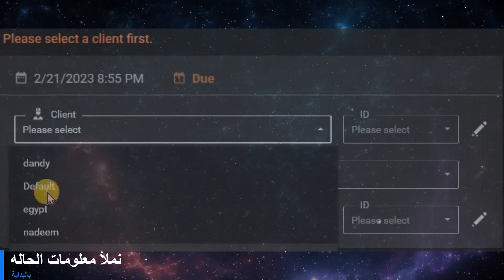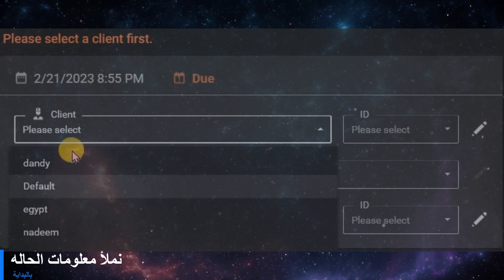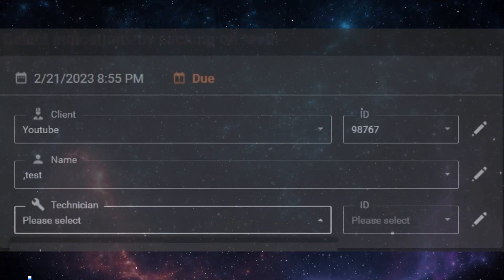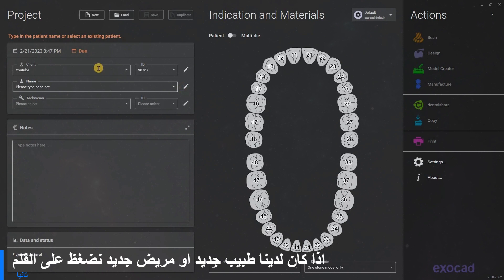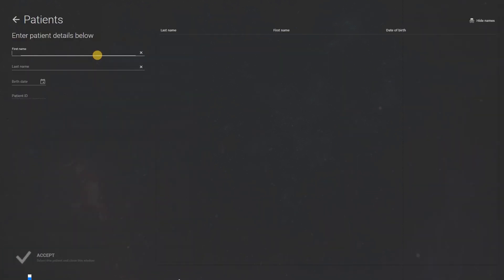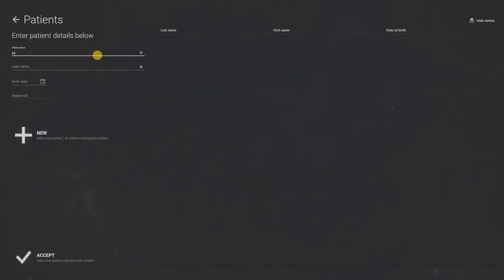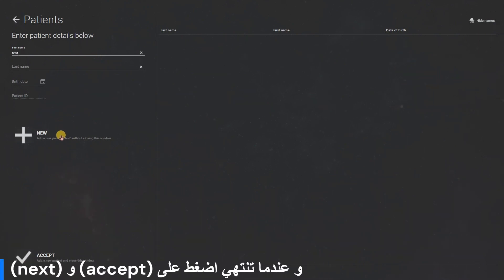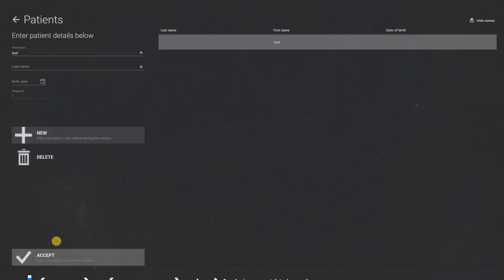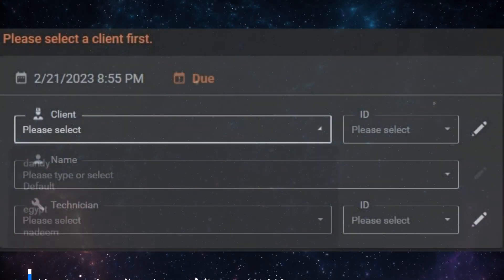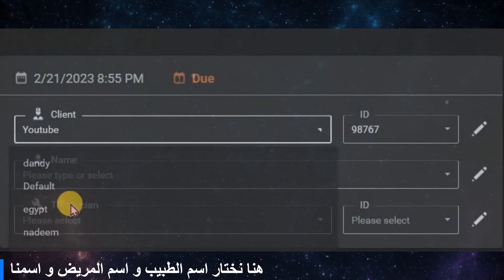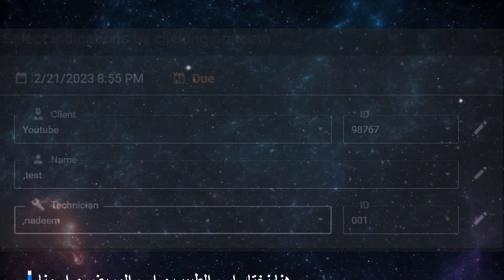At first, we must fill our project information. If we have a new patient or new doctor working with us, we click on the pen and fill the client details like that, and when you finish, press new and accept. We choose our client name, the name of the patient, and our name.